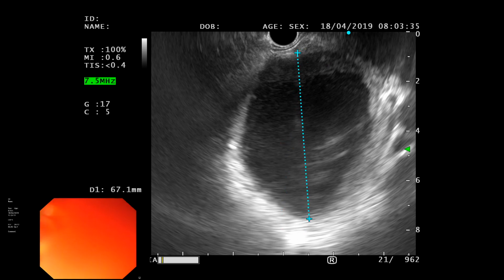So in length it's at least close to 7 almost. And I may have slightly different measurements if I go to the duodenal bulb, but I think overall it's 6 by 7 centimeter. Thanks.